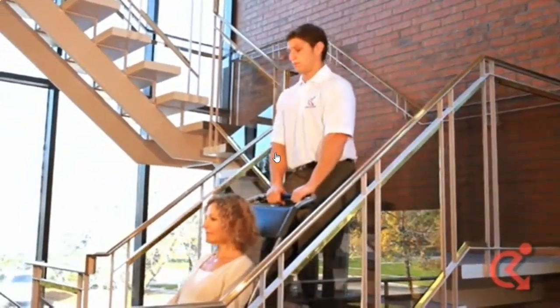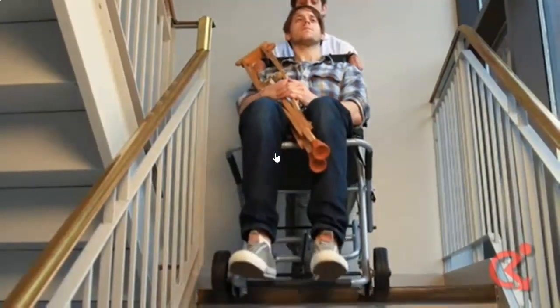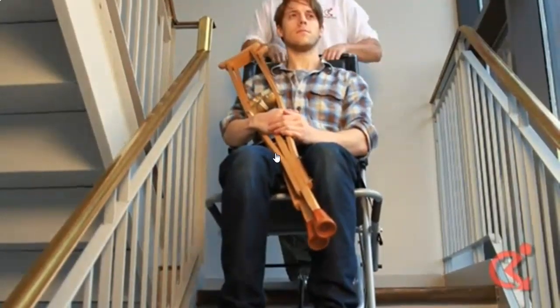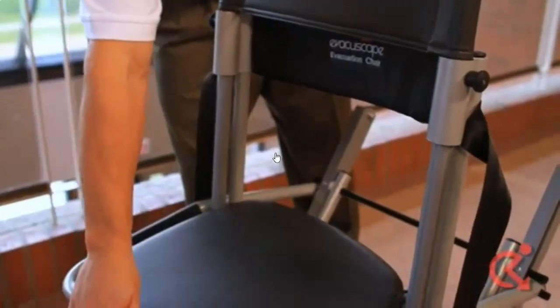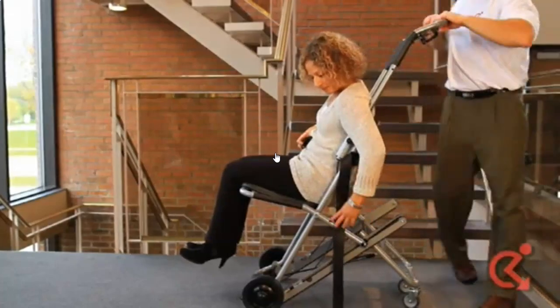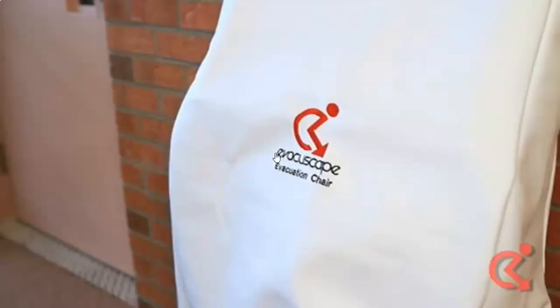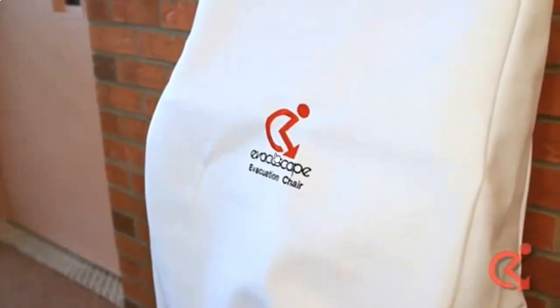The Evacuscape chair weighs 12 kilograms and can support up to 165 kilograms or 363 pounds. It is equipped with a padded seat and backrest for comfort as well as safety straps. It comes with a wall bracket and protective cover for storage. The Evacuscape chair is designed and manufactured in the UK.